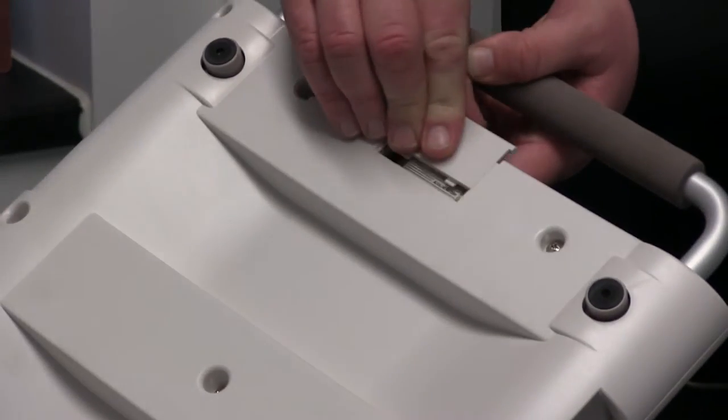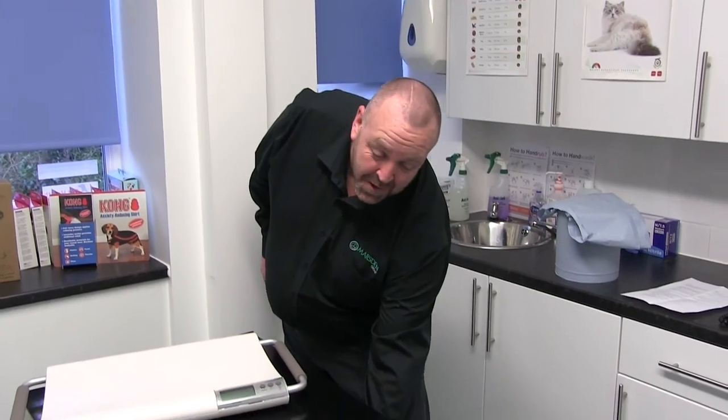Its versatile design makes it portable and it can also double as a stretcher to carry dogs and cats from one room to another. This is a battery operated scale and takes a single 9-volt battery. The V20 also comes with an optional carry case, available on request.